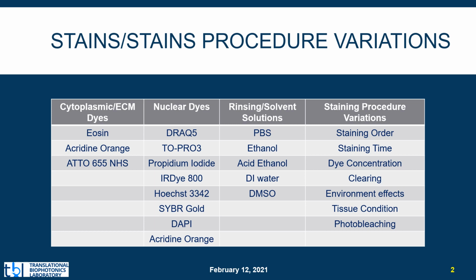One challenge for the field of ex vivo microscopy is that while the field has settled on a set of useful chemicals for staining tissue, the particular protocols used can have large effects on the quality of image obtained. Yet, a diverse set of staining protocols are reported across research groups and even within research groups. Our group is also guilty of this.